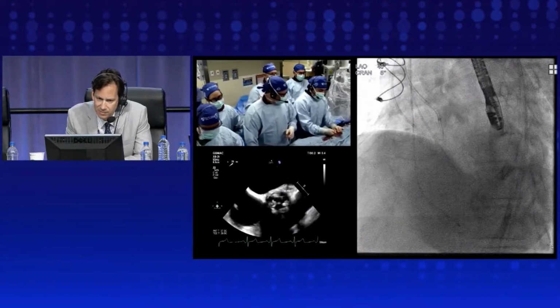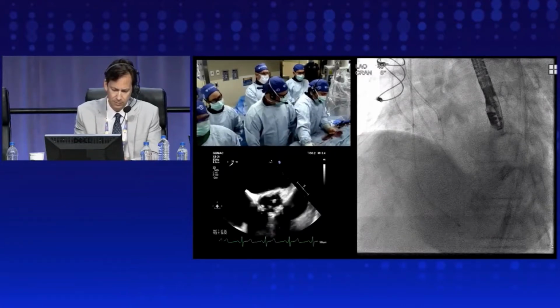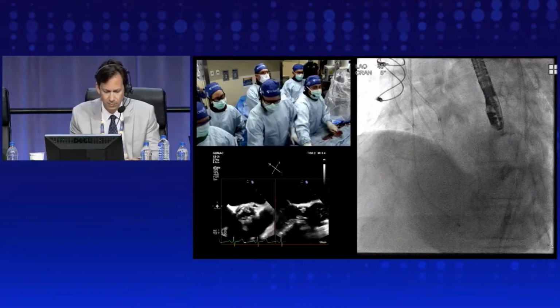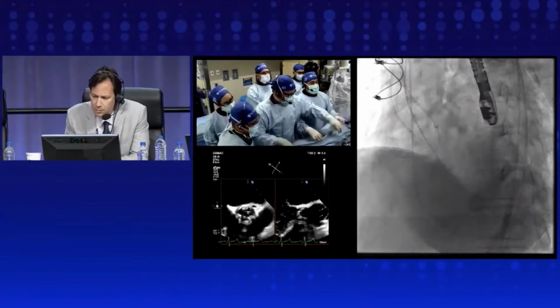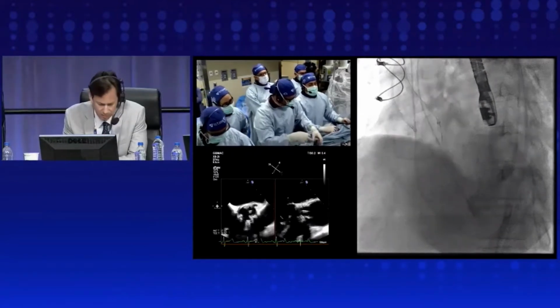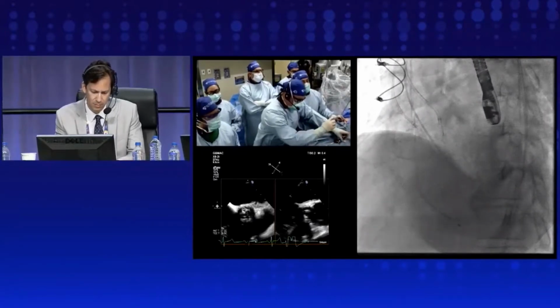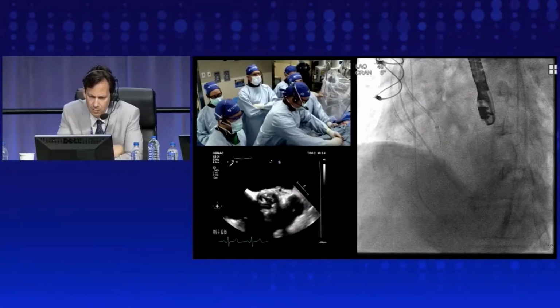Yeah, that's exactly what we're going to do. And yes, correct. We do it in double basilica only after cutting one of the leaflets in order not to have too many sheaths. So now we cut the right cusp and we have a pigtail through the big sheath, and we are able to deliver the Evolut quite quickly.